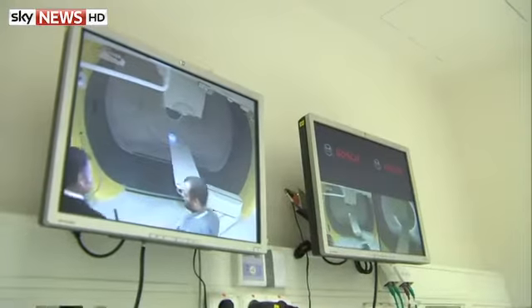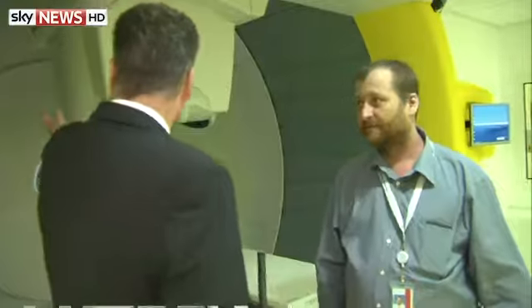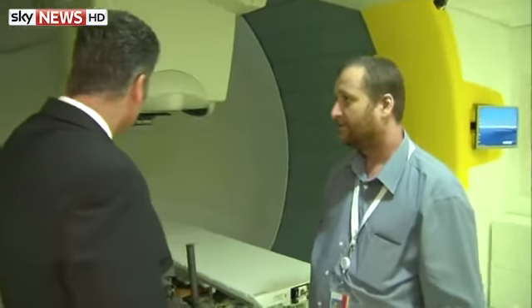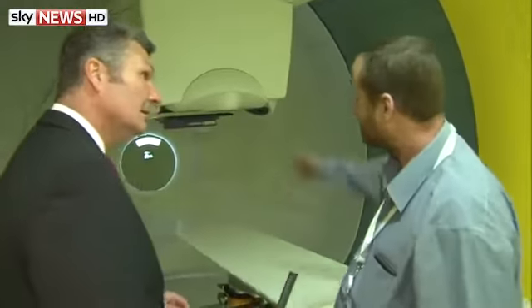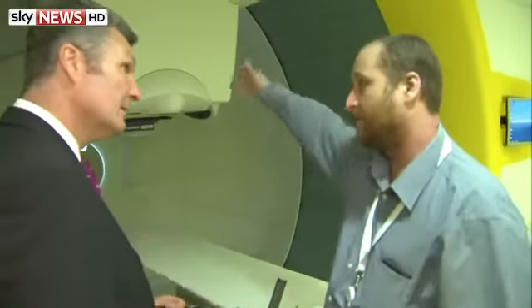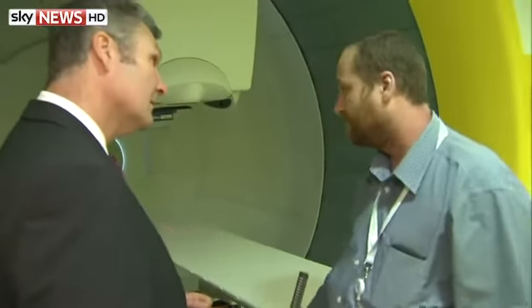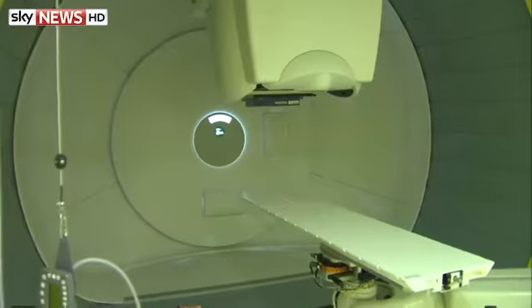And so this is it. This is the treatment room where that proton beam comes all the way through the wall and presumably out of that machine there. Yes, this is called the nozzle. This is the final part of the beam line we saw behind the wall. The patient is positioned on the treatment couch very precisely, also using 2 orthogonal X-ray images.